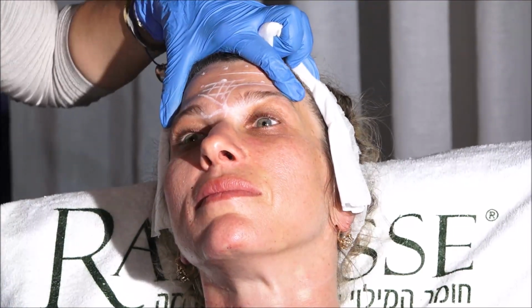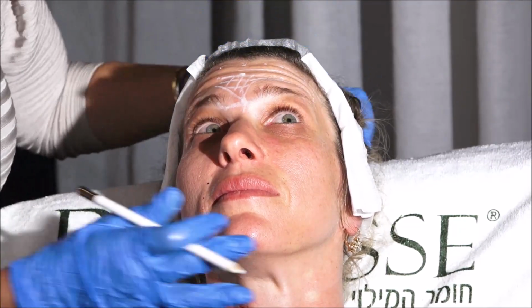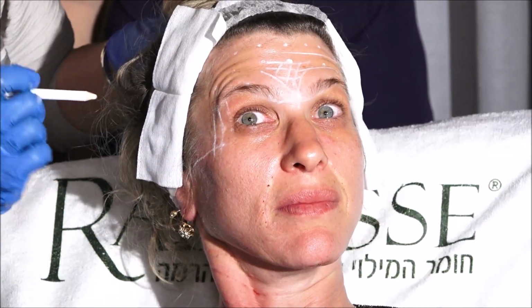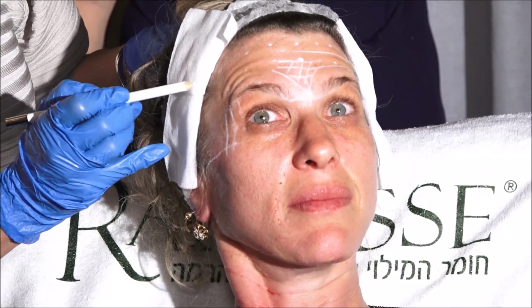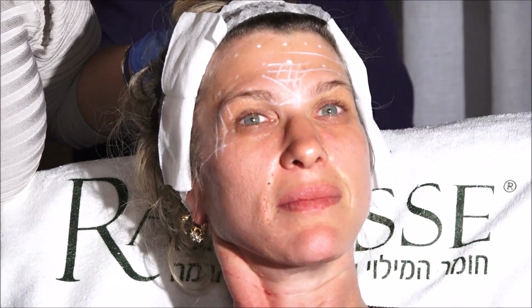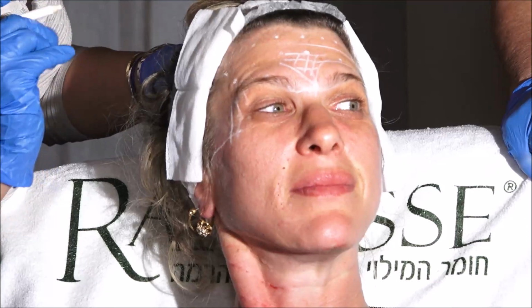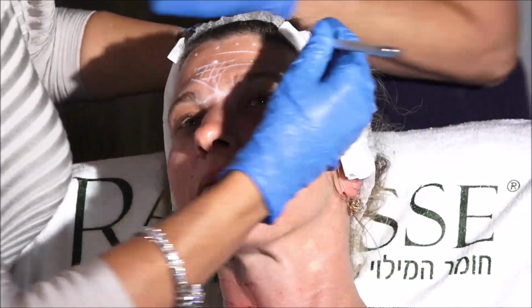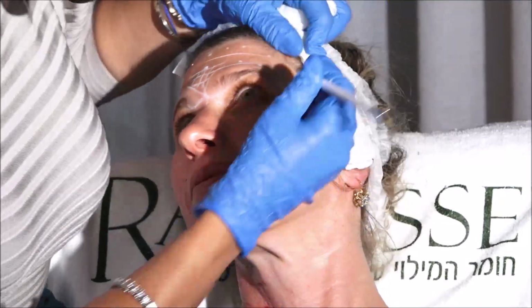What it has to be clear for her is that she has the tendency of the Mephisto. You see? When she does like this, look, contract. You see this? If you don't correct this, she will have a Mephisto. Block everything. It's horrible. So you see that I put my points here and here. The other side.